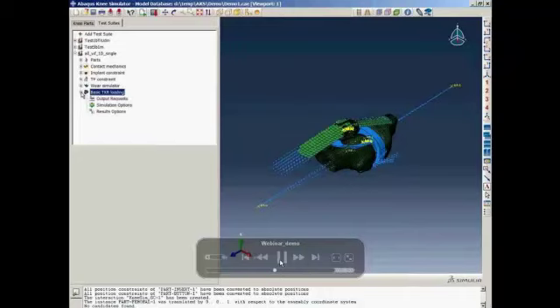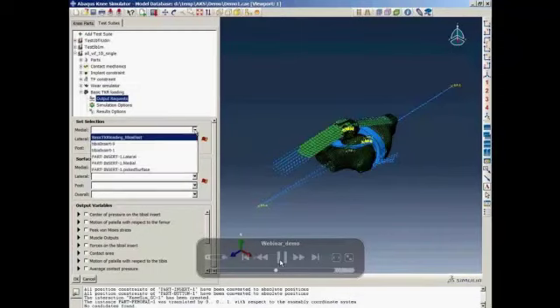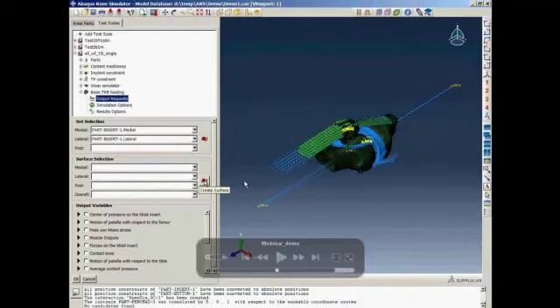So now to demonstrate, each workflow has different output requests and simulation options, but the general concept is quite similar, so we decided to demonstrate the most complex workflow for this webinar. So basic total knee replacement workflow output request. A common option for all different workflows is where the output needs to be provided. So for sets, the user can select the previously defined sets. If they haven't defined these sets, they can create these sets by clicking on this little icon on the right.